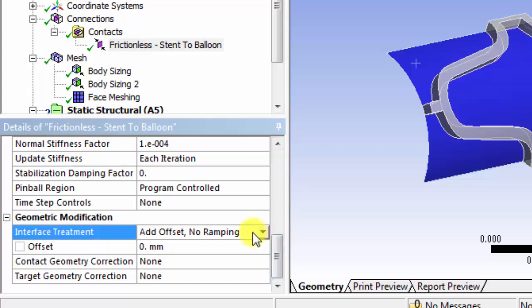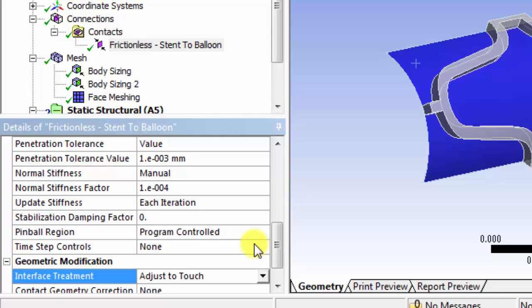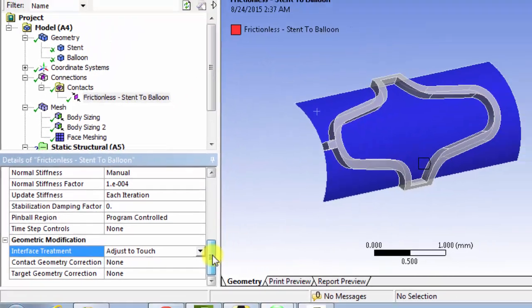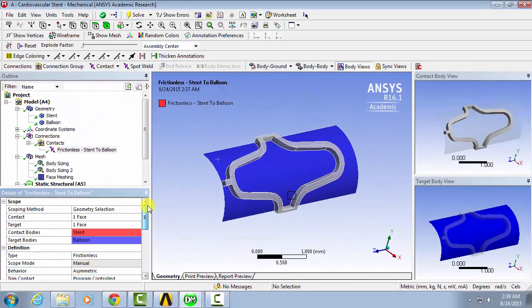And then under interface treatment, we'll select adjust to touch. And this will define the contact region for the type of problem that we have.